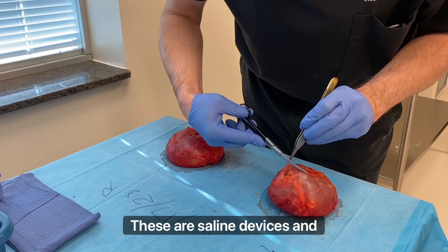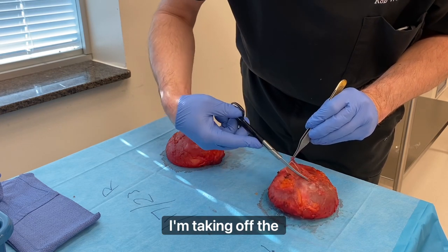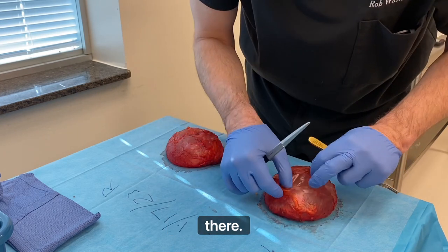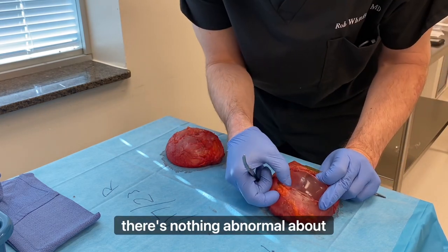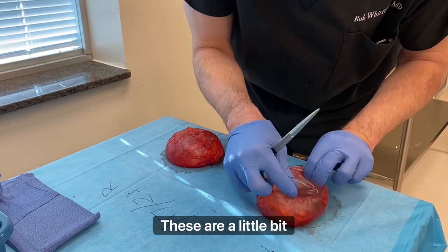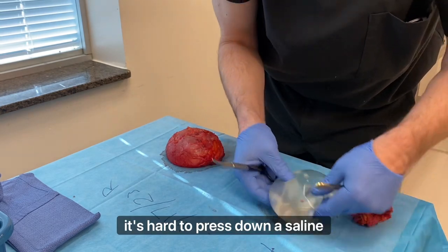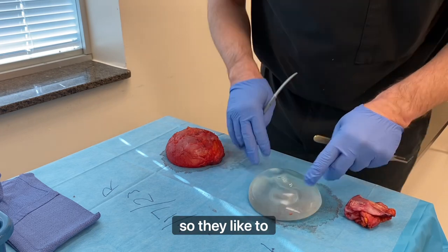These are saline devices, and sometimes I cut into them when I'm taking off the capsule. You can see the fill valve of the saline right there. It's intact. There's nothing abnormal about these. These are a little bit challenging to take out from the plastic surgeon's side because it's hard to press down a saline implant — they don't like to compress.